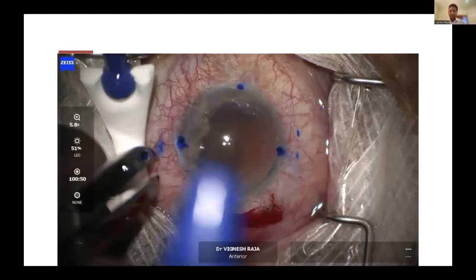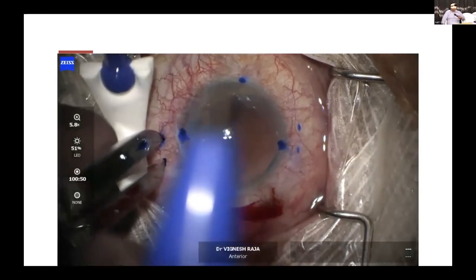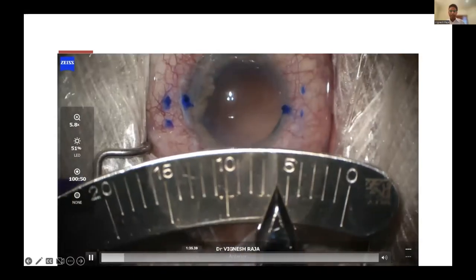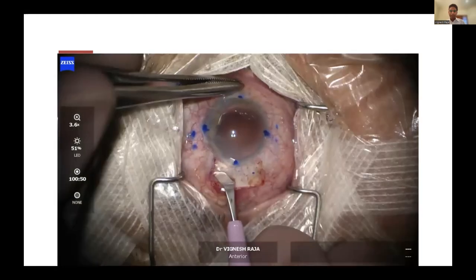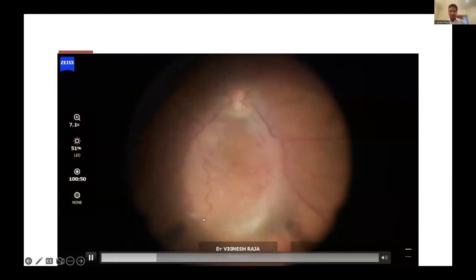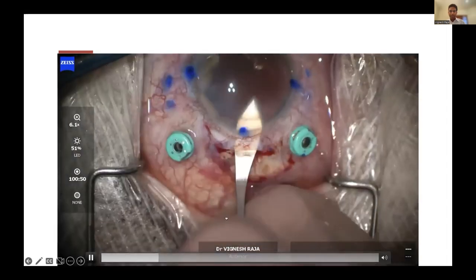So I'm marking the Yamane. Please carry on. Yeah, I'm marking the Yamane, and then I'm making a 6 millimeter scleral tunnel. I won't bore you with these details. He's also got an epiretinal membrane, so I did the vitrectomy for the epiretinal membrane at the same time.